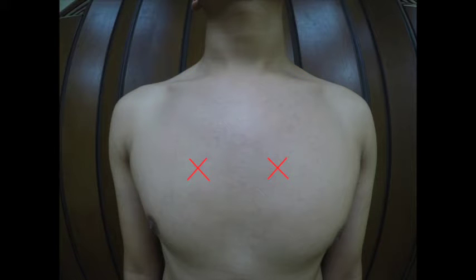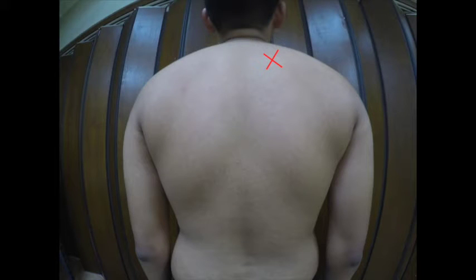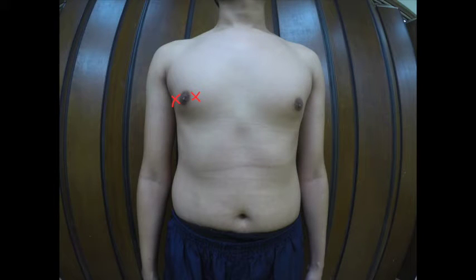For the anterior segment of the upper lobe of both the right and the left lung, place the stethoscope between the clavicle and the nipple area. For the posterior segment of the upper lobe of the right lung, place the stethoscope at the root of the spine of the right scapula. Middle lobe of the right lung, place the stethoscope medial and lateral to the right nipple. And for the lingula of the left lung, place it superior and inferior to the left nipple.